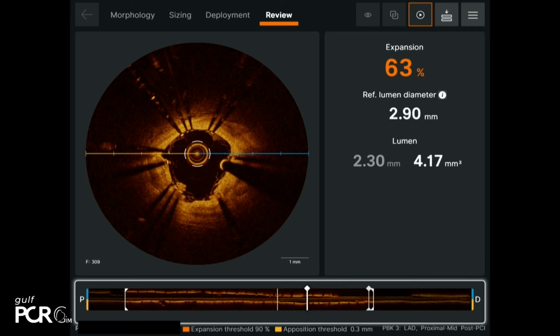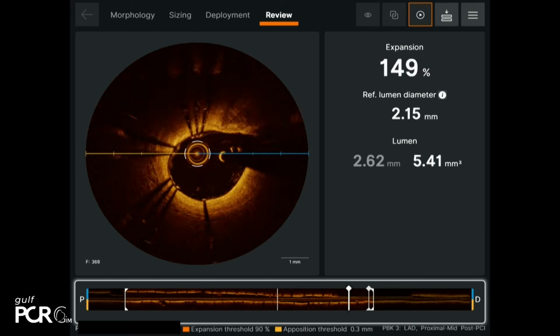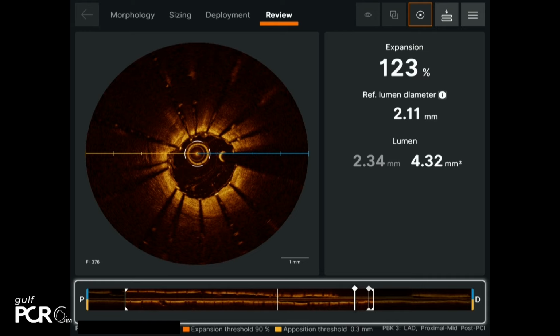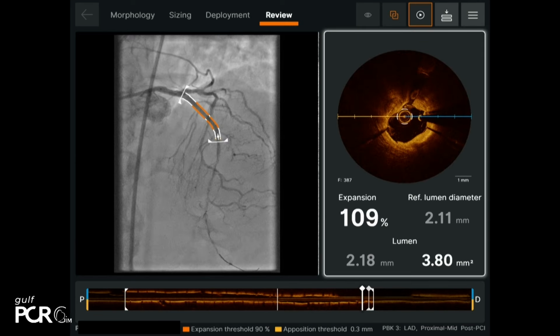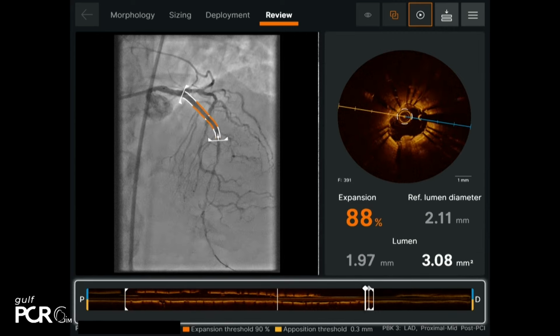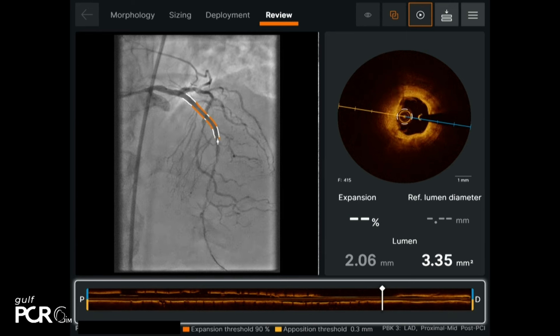Can you show us just the distal part of the stent and the image just distal to the stent? And maybe Giulio, you could comment on this image. So just distal to the stent. If you go to the distal edge, pull back a little bit. Of the stent, distal edge. Small dissection there.